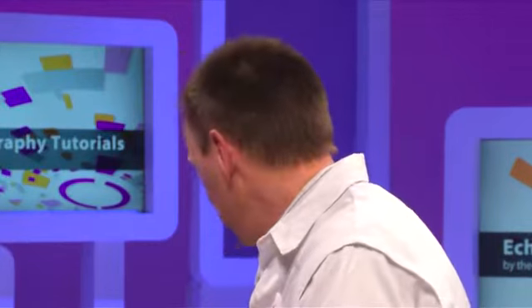So I've been asked to demonstrate the difficult topic of multiple valve disease, and obviously I will not be able to show every situation of these complex situations, but I would like first to start with the case of a patient who presents aortic stenosis and mitral regurgitation.